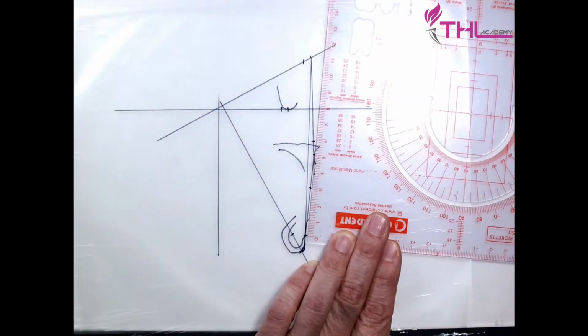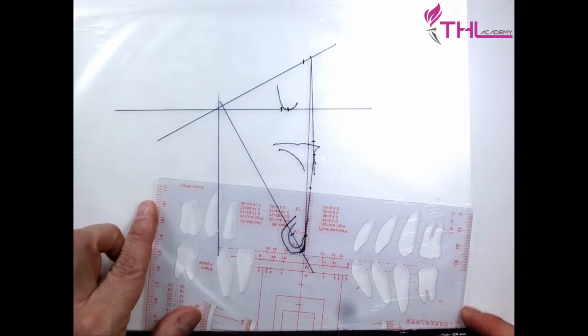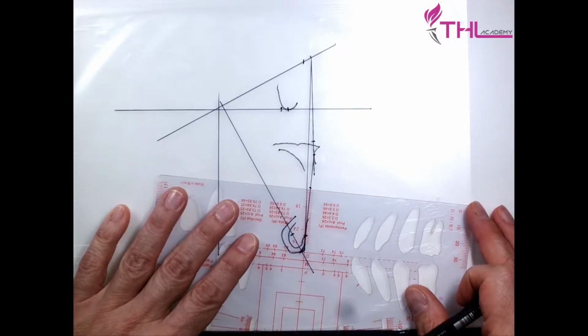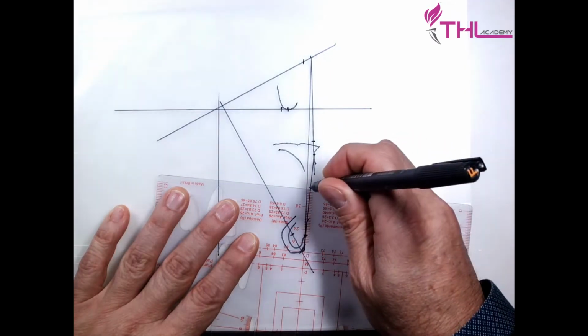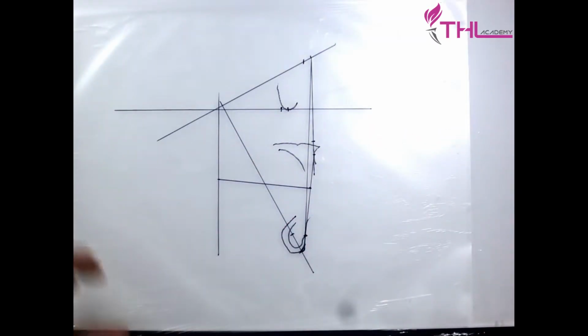We divide it into 30, we are dividing the golden ratio. Remember the rule of the 90 degrees? So 50%, I can draw now 90 degrees with the ruler. We will draw the occlusal plane through this, which is the occlusal plane we are constructing.